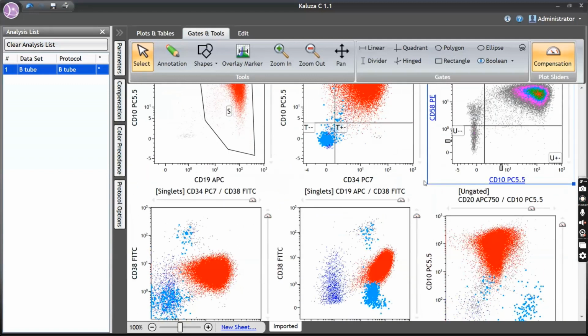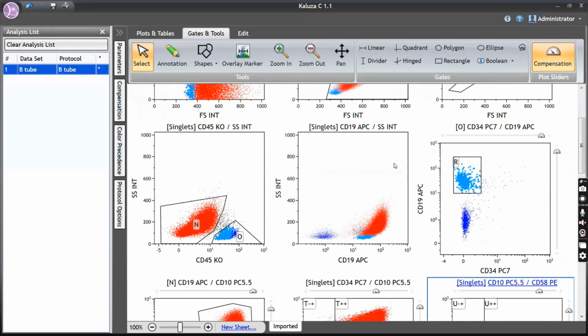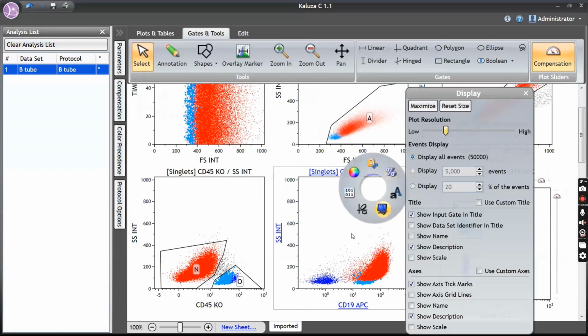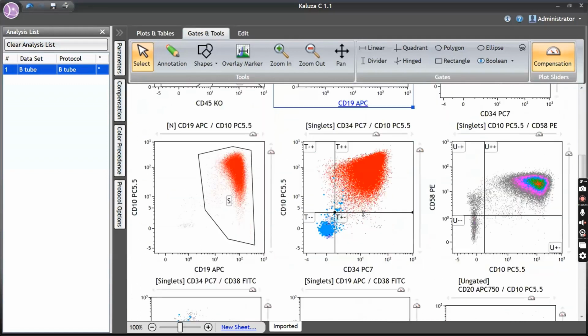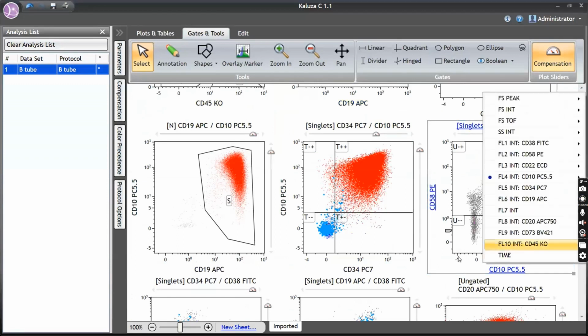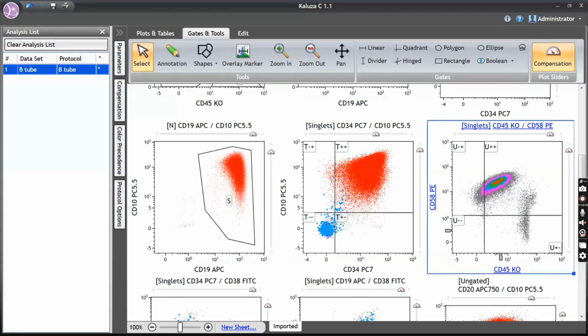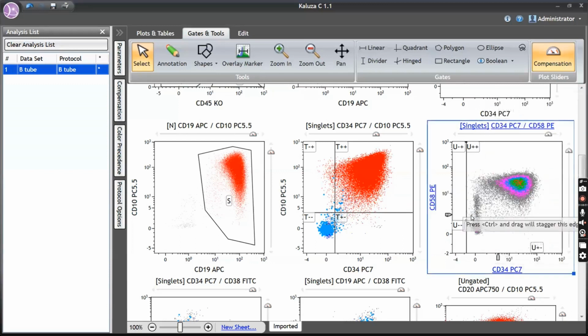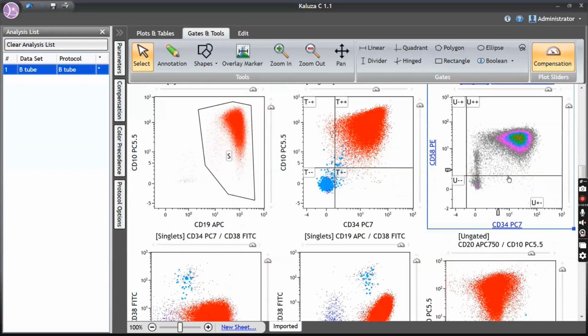If you want to see along with the internal control, let me go back and see whether some neutrophils are there. Are there any neutrophils? There are hardly any neutrophils. So I don't have an internal positive control here. But what I can have is some negative controls. So this is how it is: moderate to bright 58. Yeah, it's moderate to bright.